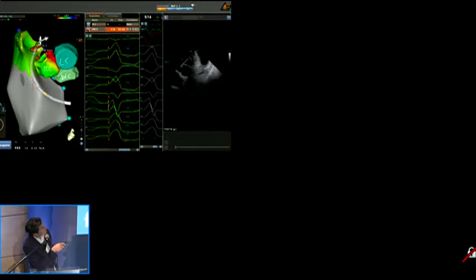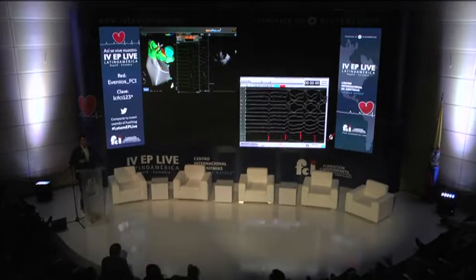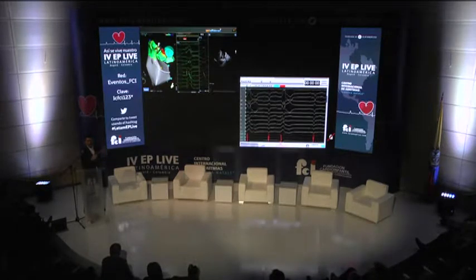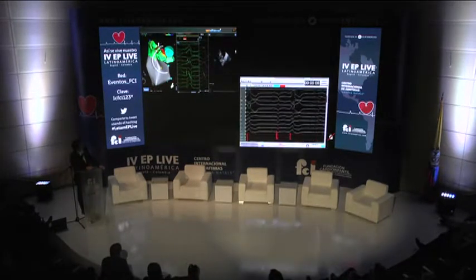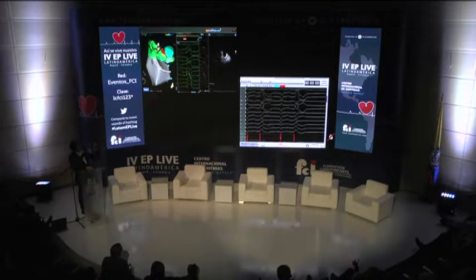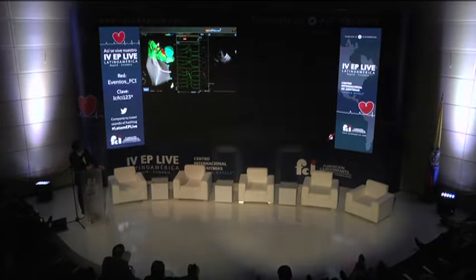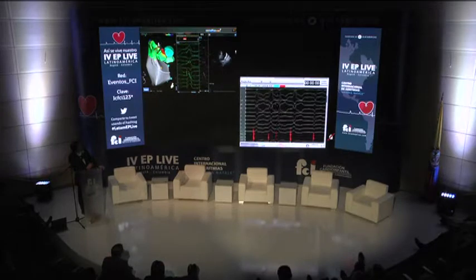0.92. Diego, you need to exclude the spike from the comparison window. Yeah, that is true, you're right. There it is. Okay, if that is true and it is well captured, probably the friends who said that they needed to start on the right side might be right.